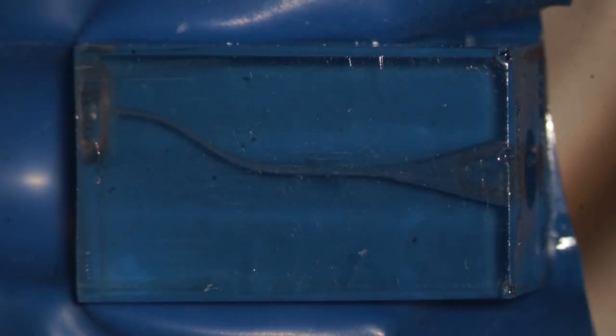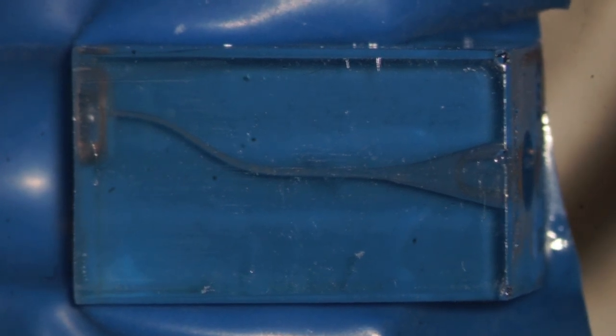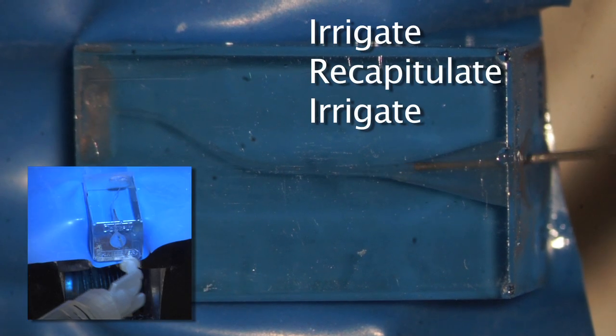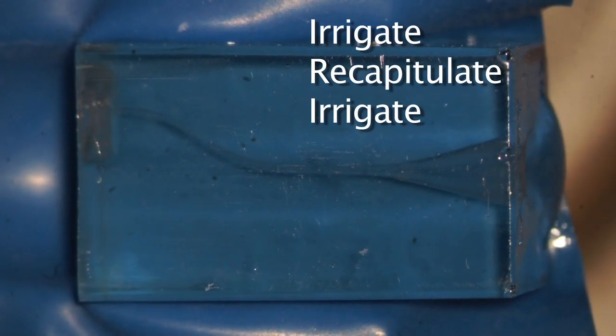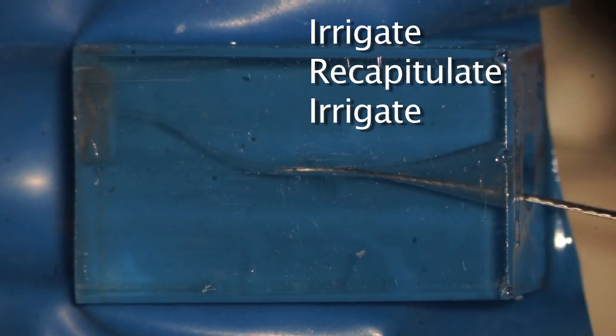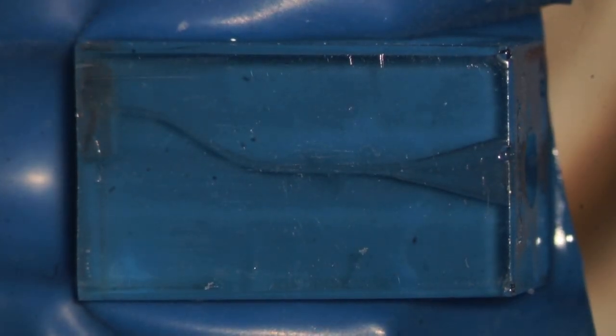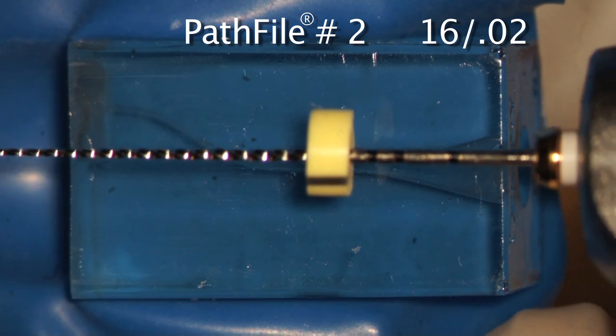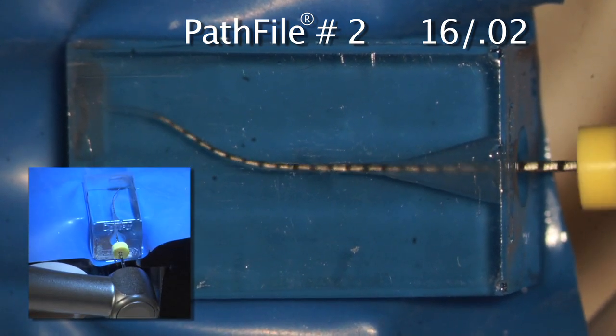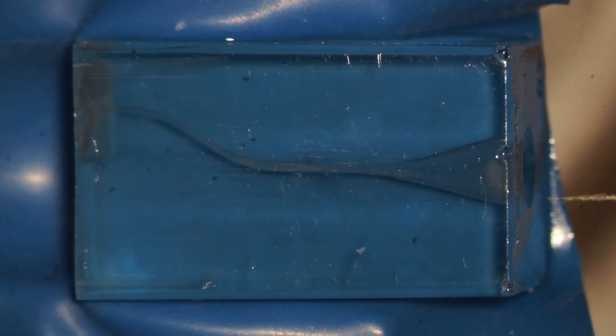Between rotary instruments we should always do the big three. And what we should do is we should irrigate, because a little bit of debris has been accumulating, and by irrigating we keep that debris loose and in suspension. Now we can recapitulate with a ten file, and the ten file just assures that we still have our glide path. With a known glide path, we can come right back in with path file number two. This is a 1602, and we can spin, and it'll feed right in and follow the glide path perfectly to length. Once we've achieved length, we can come out.